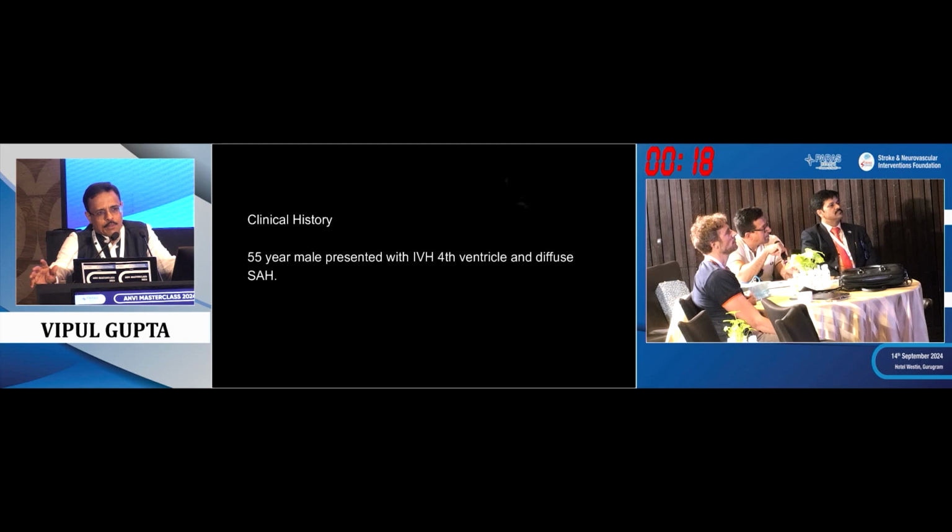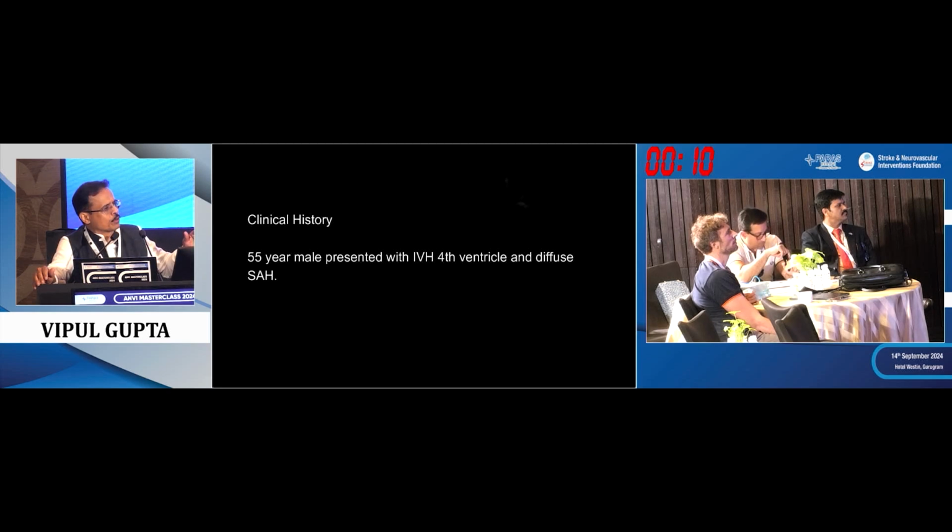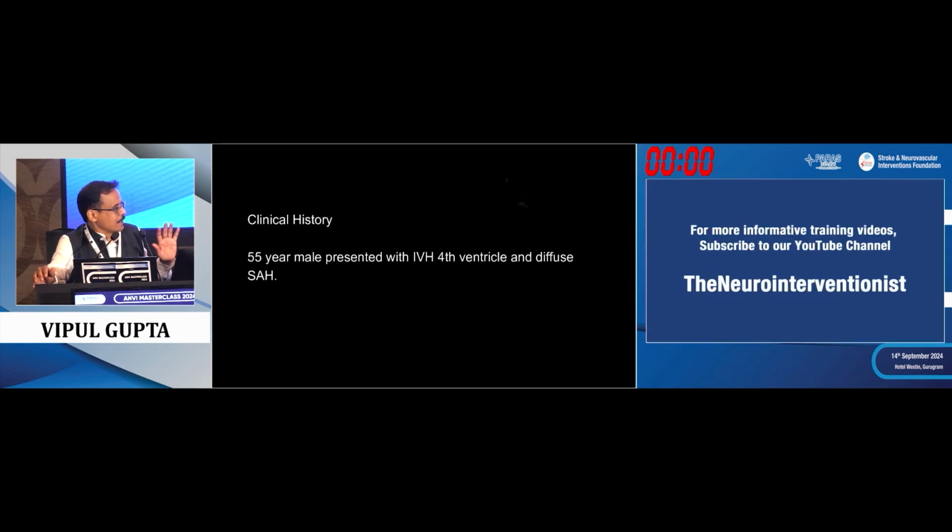But we wanted you to also know that there are different protocols, and we have a protocol. As long as flow is changed in small aneurysms, even when there is a hemodynamic change, we may not see it angiographically. That's the physics. So I would love to see that. Even if I don't see that, if my flow diverter is well opposed and everything, we are okay with it. That's what we have been doing.